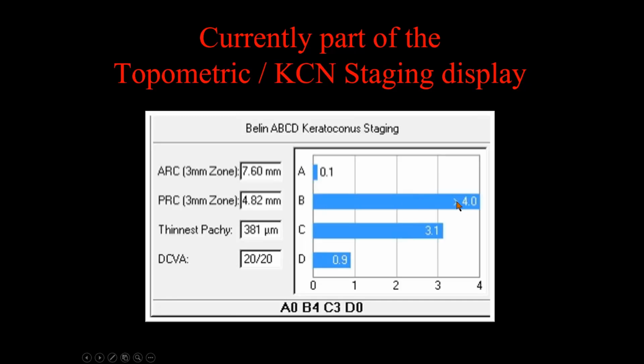The posterior surface is actually greater than stage 4, but you can say like distance visual acuity here, we're almost to 1 here. This is slightly above 3, but you can get a better feel. So this again will tell you, for example, if someone is 181 pounds and someone is 199 pounds, they may be in the same grouping, but they're clearly different. This will actually show you where they fall in that grouping.